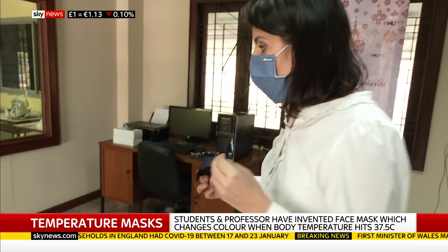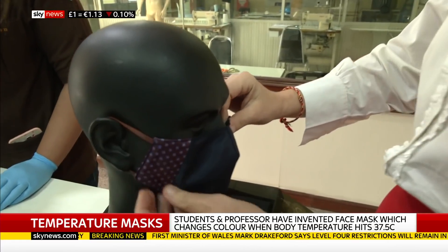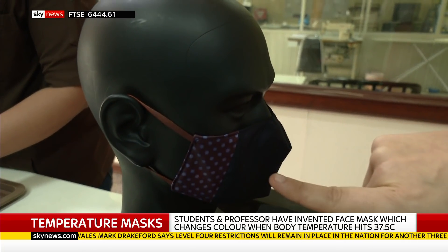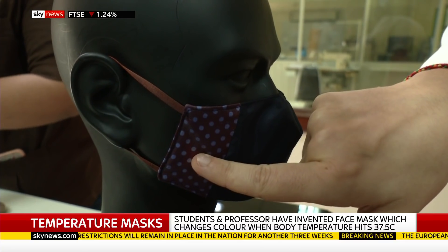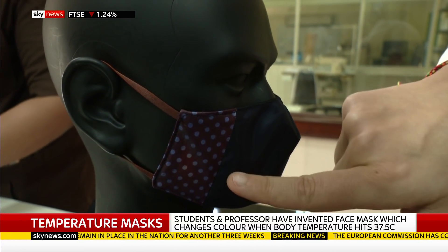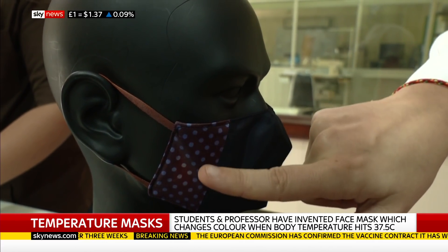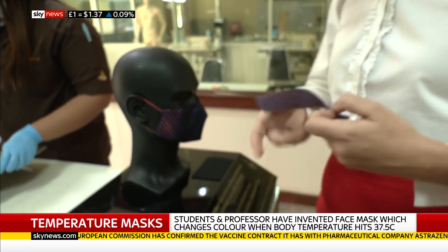We can see it working in action now. This is a heated mannequin. I'll put the mask on it and where you need to be watching really is these side areas — you should start seeing a change in around 20 seconds. You can already see some of these dots here are changing colour, going first from blue to white, because this outside coating is changing to clear.